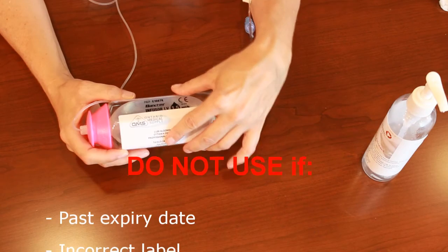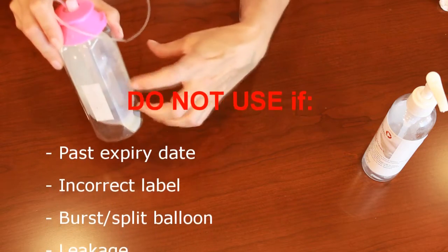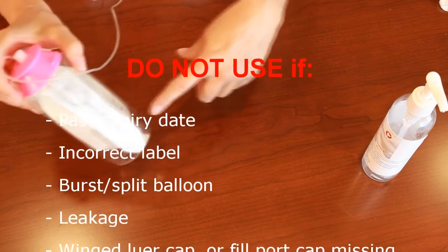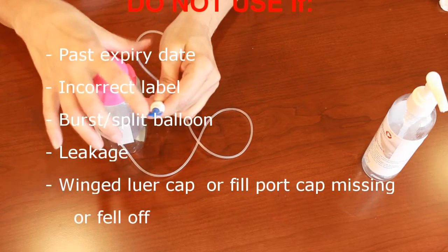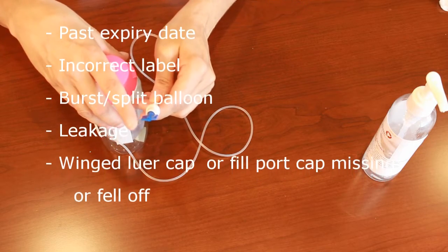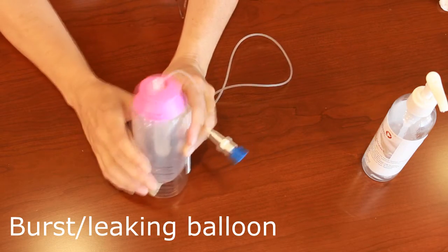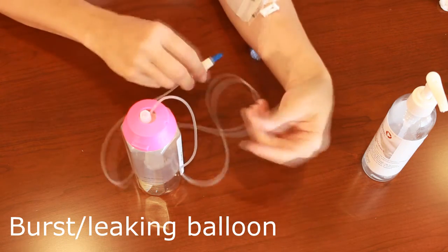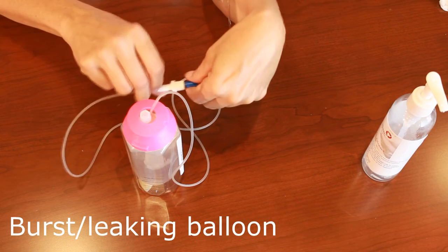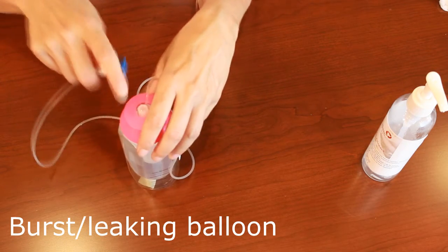Some tips for troubleshooting: do not use the pump if it's past the expiry date on the label, if the patient label on the device is incorrect, if the balloon splits or bursts, if there are signs of leakage inside or on the outside of the device, or if the blue wing cap is missing when starting the infusion. If the balloon bursts or leaks, close the clamp on the catheter, disconnect the tubing from the vascular access device, flush and lock the catheter as per policy, and notify Medical Pharmacy about the leakage.